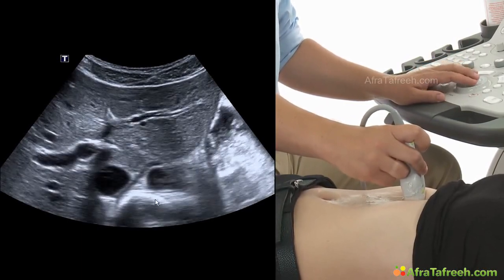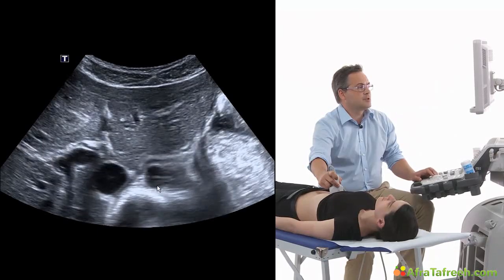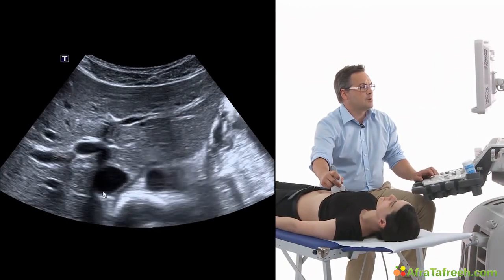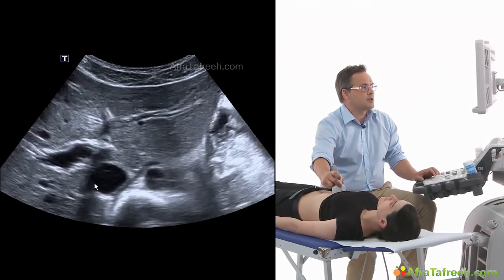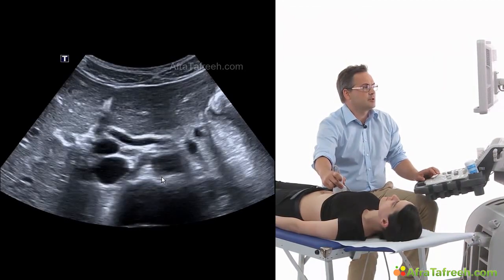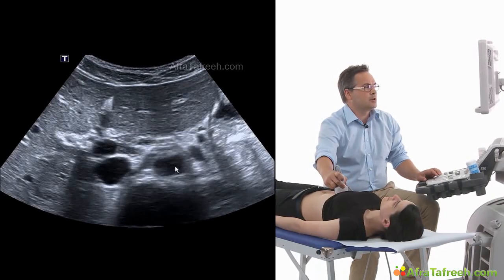We can see the lumbar vertebra over here, the pulsating aorta in the midline, the IVC on the right side of the midline, and so we go on scanning the aorta by moving the probe slowly caudally.